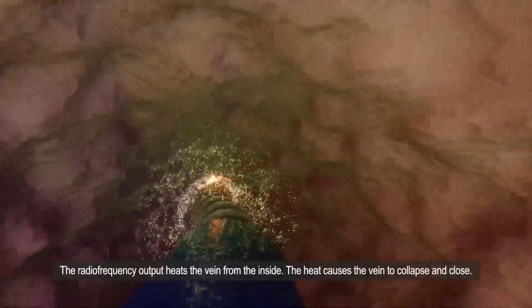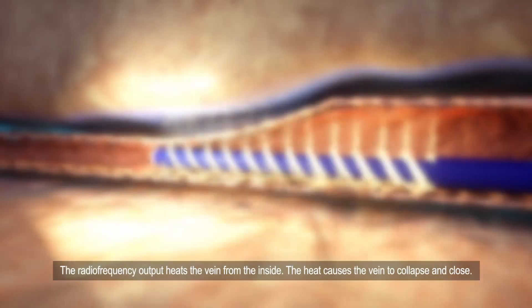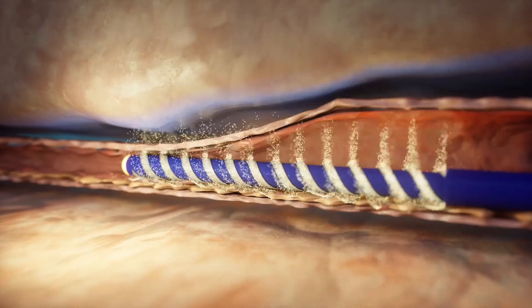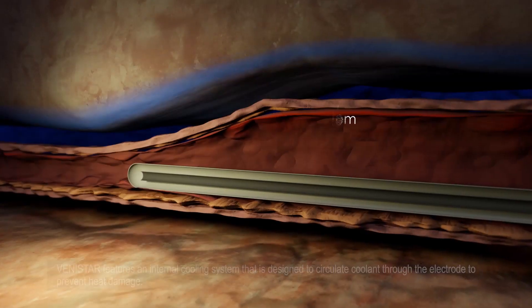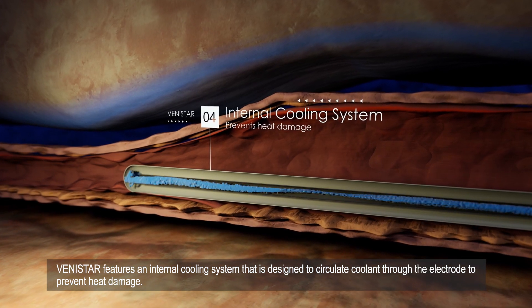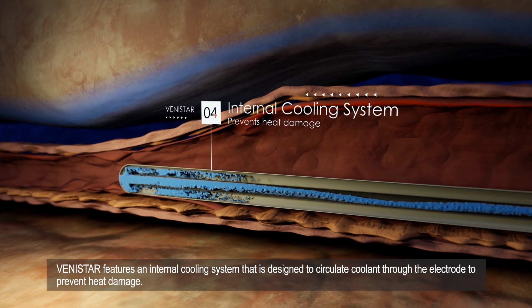The radio frequency output heats the vein from the inside. The heat causes the vein to collapse and close. VENISTAR features an internal cooling system that is designed to circulate coolant through the electrode to prevent heat damage.